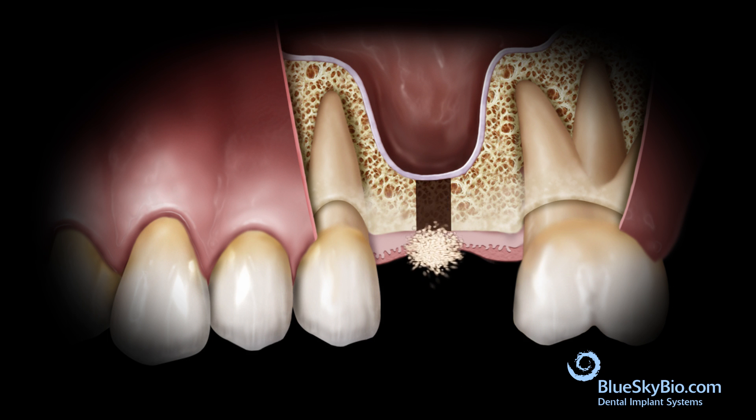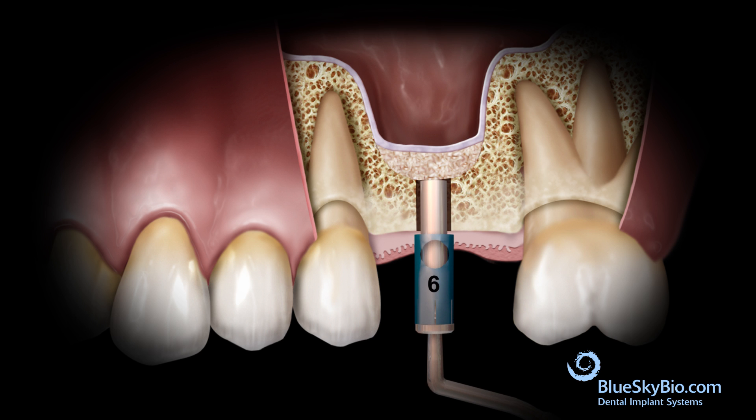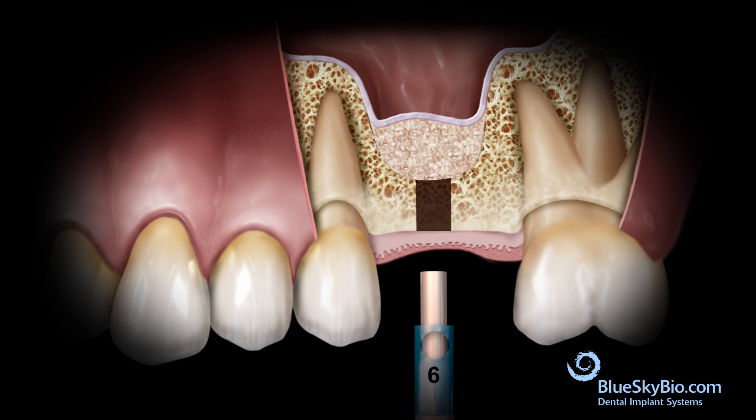Small granules of bone graft material are brought to the site. The previously used stop is attached to the bone packer and the graft material is condensed into the site. It is important that the sinus membrane is lifted by the graft material and not touched by the packing instrument.